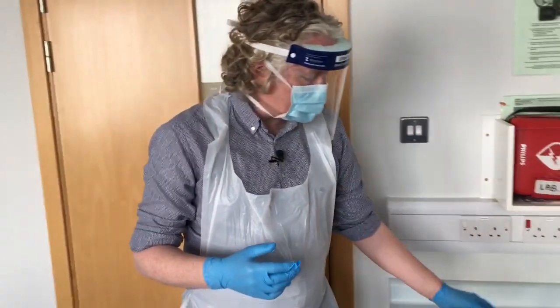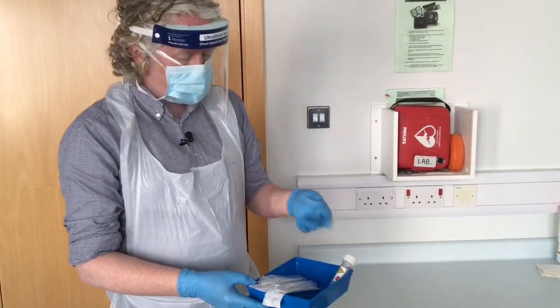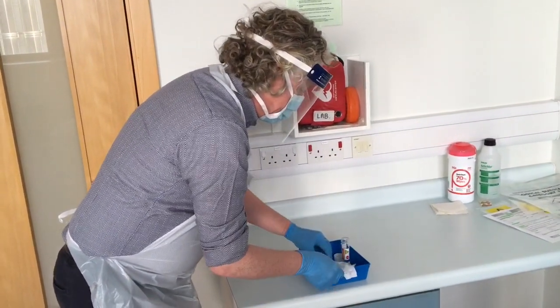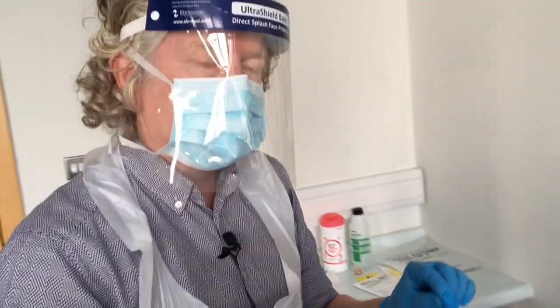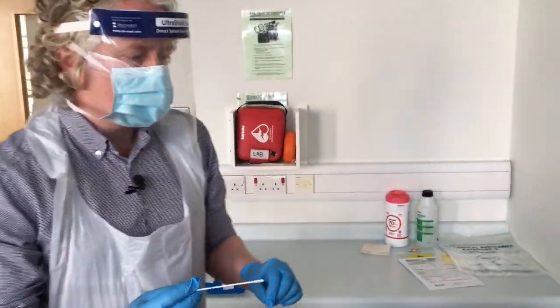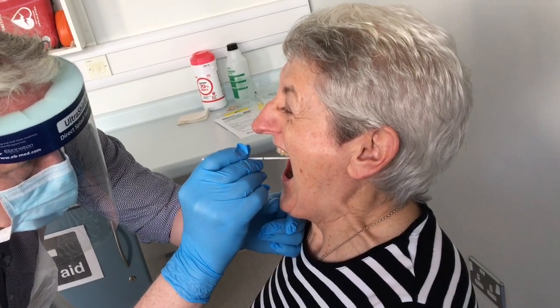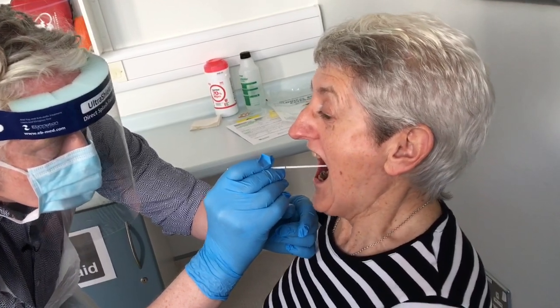I've put my PPE on outside the room and I'm ready to go in with the materials I need — the swabs and the sample bottle. I'm going to take the throat swab first. It is a throat swab we're after, and we're trying to go to the very back of the throat around the tonsils — that's how we get a good sample. Could you open your mouth please? Position your patient as comfortably as you can. Go right back to get the sample from the back of the throat; you can go on both sides of the tonsils.